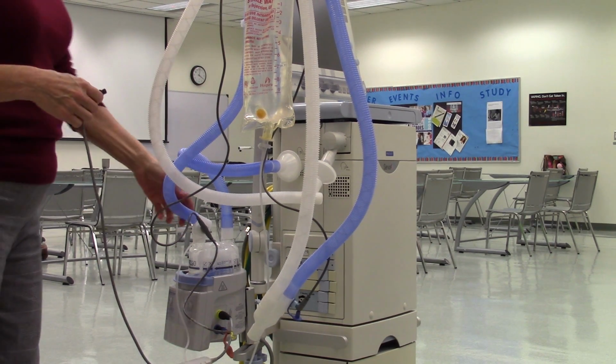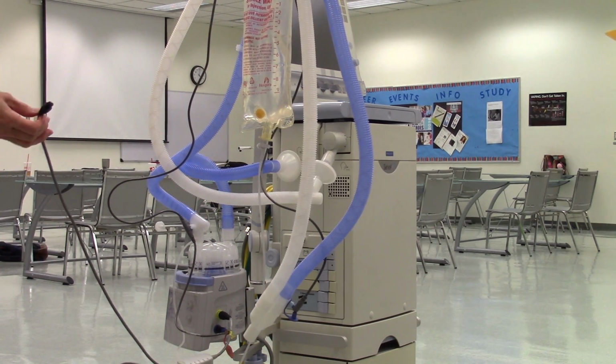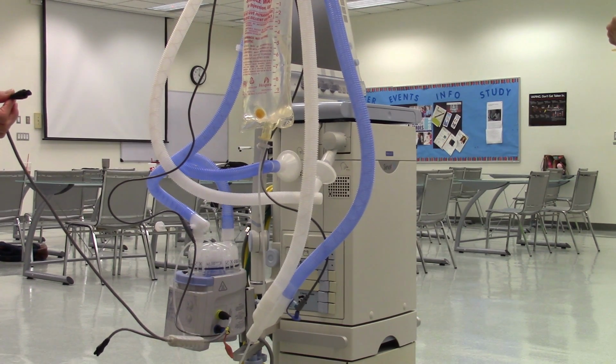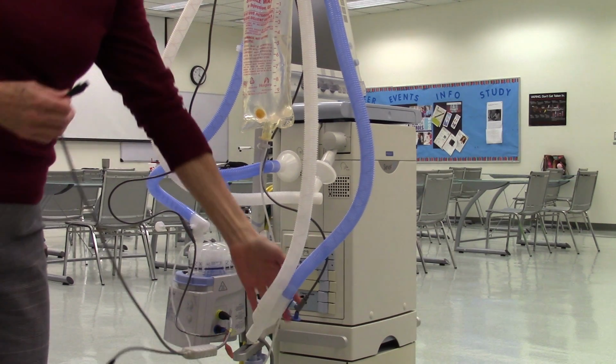So that's detecting the temperature at two points then? Yes. Yeah, so at the beginning, right off the humidifier, and then at the patient end.